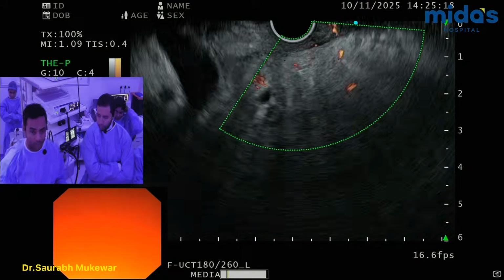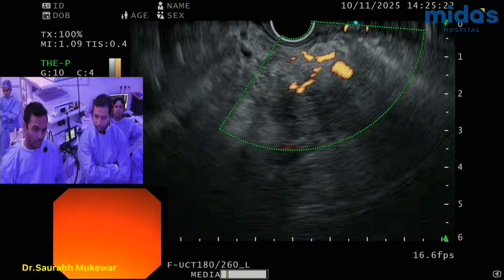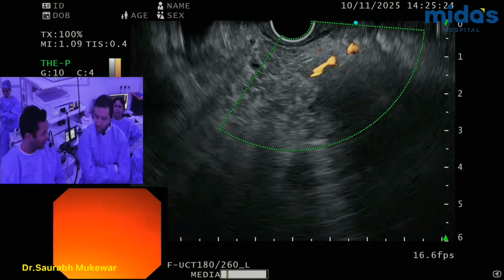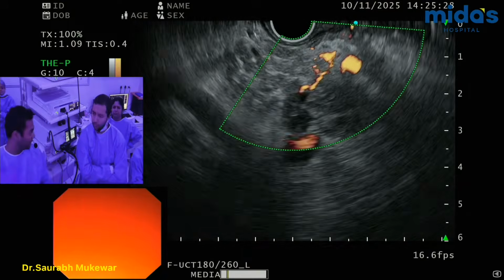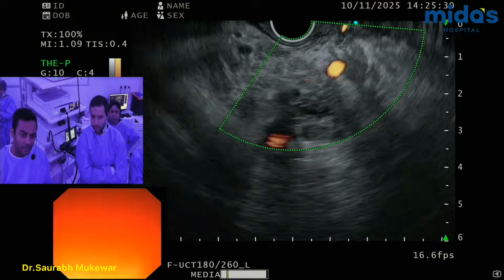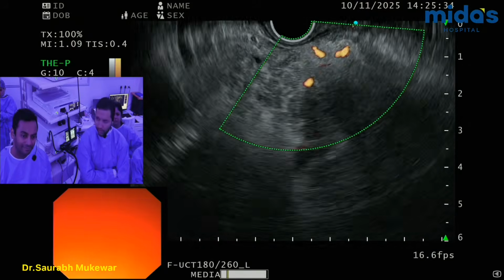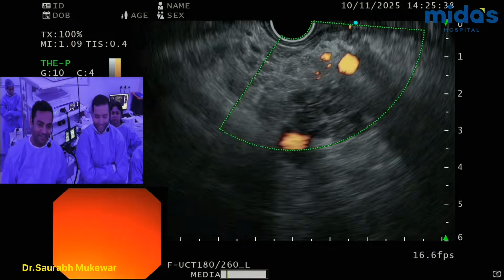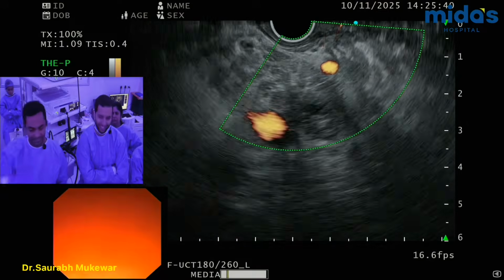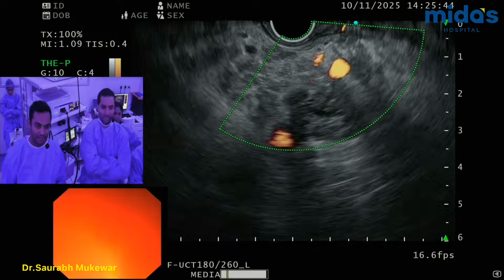What I could have done slightly differently is to give negative wet suction. If you don't have an assistant, it's probably a good idea to use negative wet suction, which is negative 20 cc with a saline-filled syringe. In some centers, they told me that it depends on who they trust, the cytologist or the pathologist. We have the same here, both are the same, so it doesn't matter. They do it here, but not in this case. I won't bother. I'll ask her to do a proper evaluation.